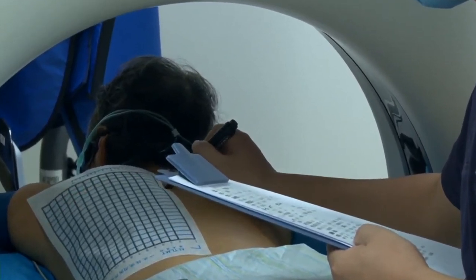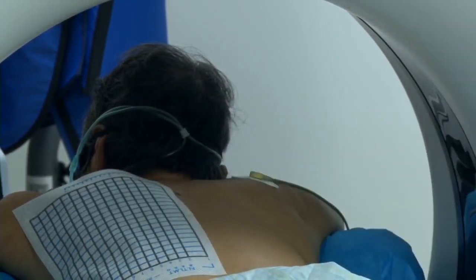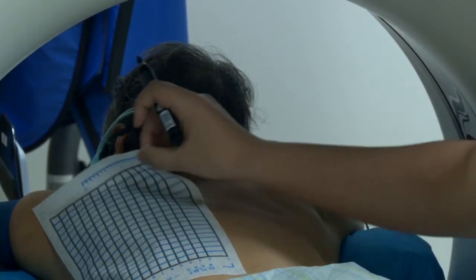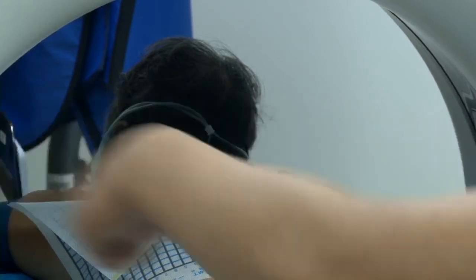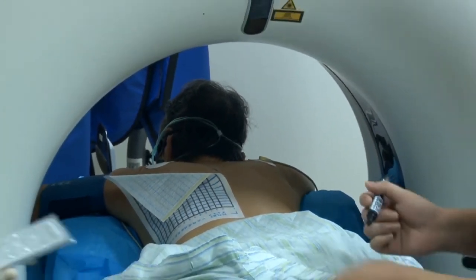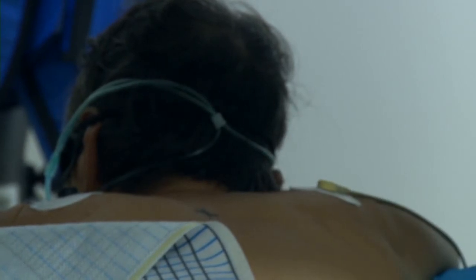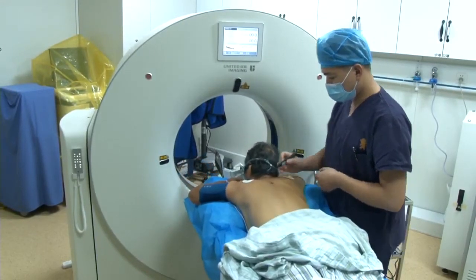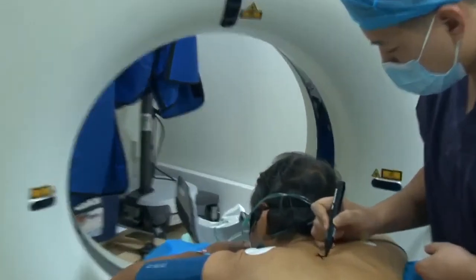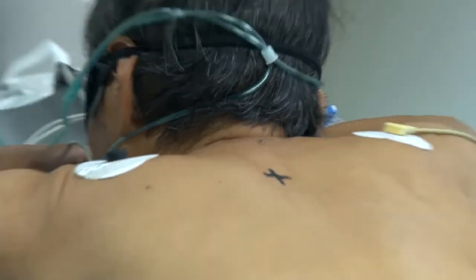Yeah, he's making the marker of the puncture. Okay, here's the marker.